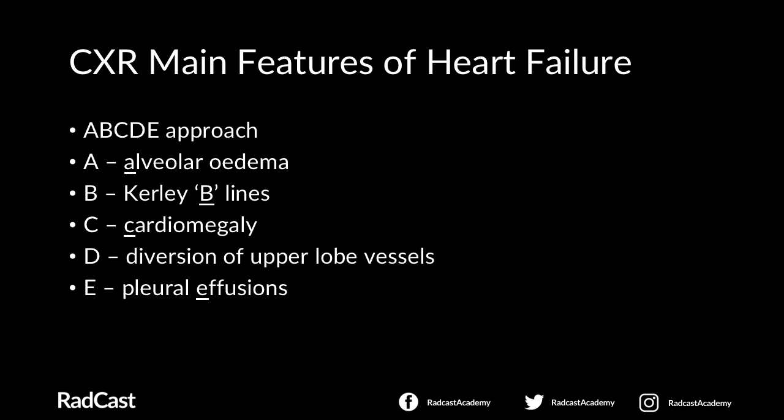We'll go further into each step as to why this occurs and how this is visualised. But if you don't mind, I actually want to explain these by changing the order and approach this in a kind of chronological fashion, as certain changes are mainly seen as certain milestones of severity, although this isn't an absolute rule. Also, we're assuming pure left-sided failure in this talk for the purposes of assessing pulmonary edema only and fluid overload within the lungs.